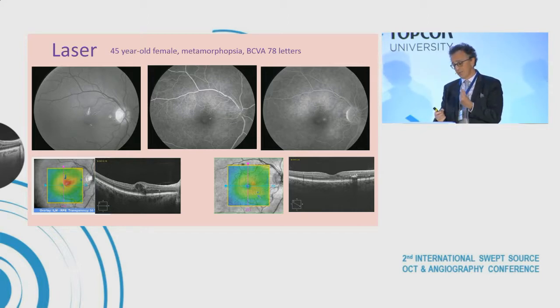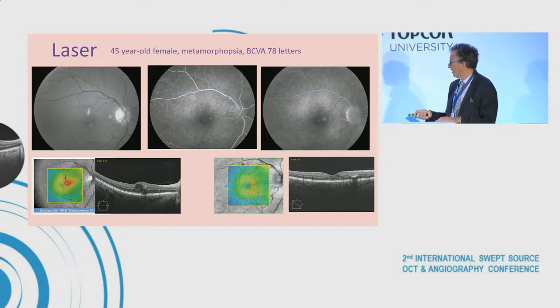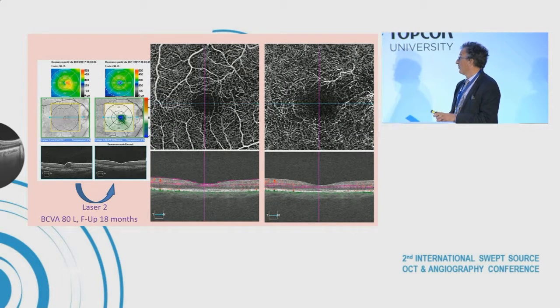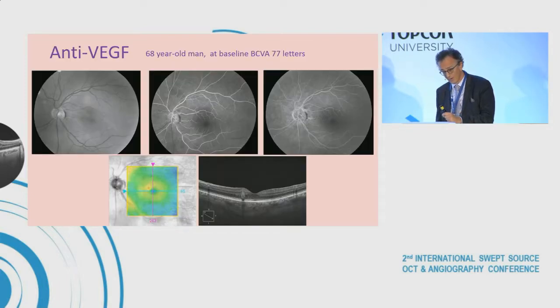a type 3 neovascularization. So he decided to treat with 3 intravitreal injections, but there was no change, and she was referred to us at that time, and we observed this PVAC lesion. So I decided to treat the patient with laser because she did not want any more injections, and finally it worked initially, but we had a recurrence 7 months later, and I treated her again with laser directed towards the lesion, and finally it worked. We have a follow-up of 18 months without recurrence for this lesion. Not so difficult to treat. Finally, it's like a microaneurysm.